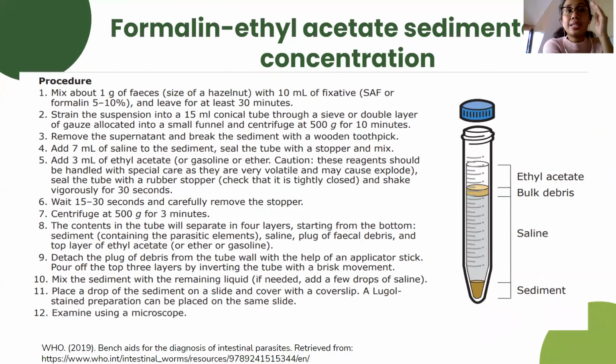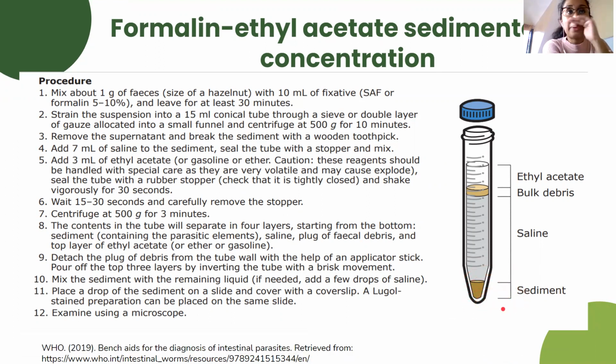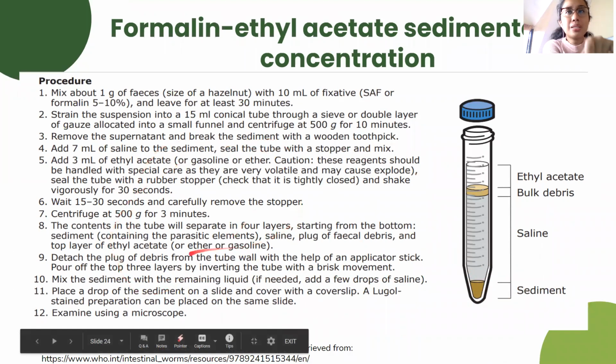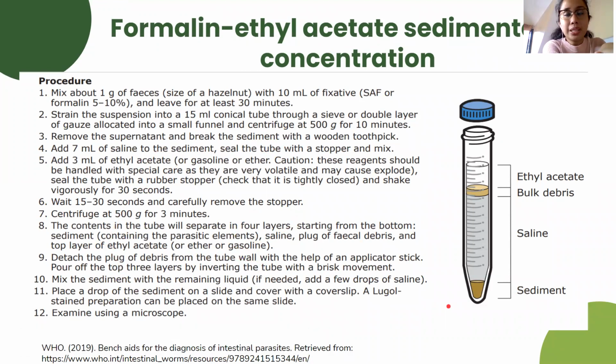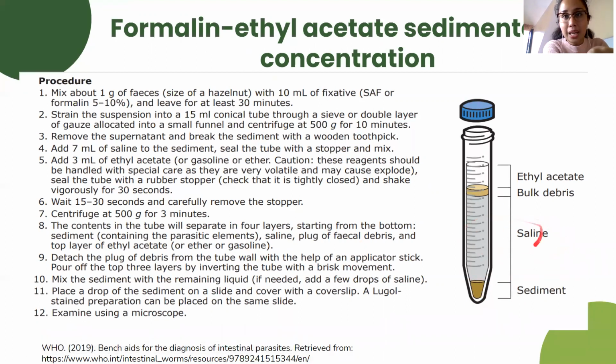So class, this is sedimentation. So expect that the parasite of choice, yan, parasite na hinarap natin, nasa sediment siya. Yan. So class, actually, yan, you could read, yan, please pakibasa yung mga steps. So class, after doing all the steps, yan, you will centrifuge it. And class, expect that the sediment is at the bottom. The saline or formalin is here.